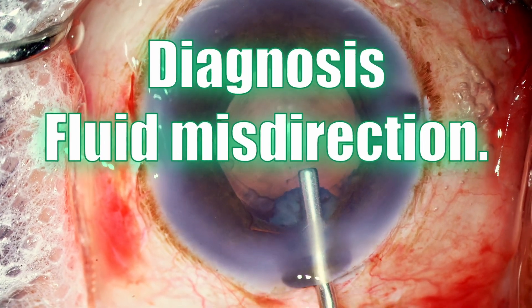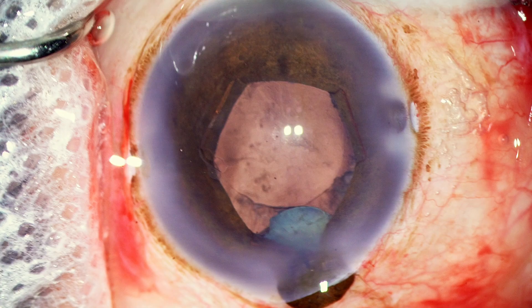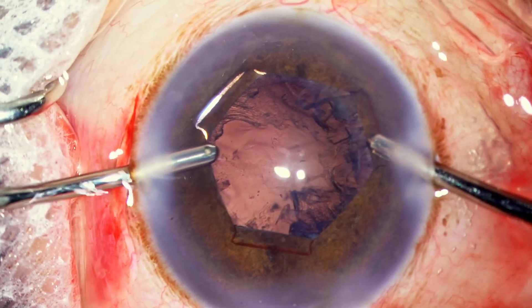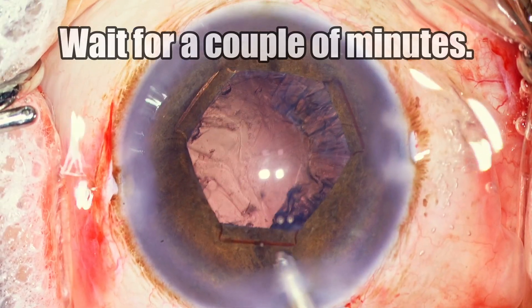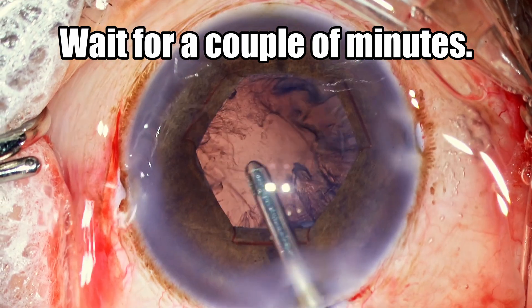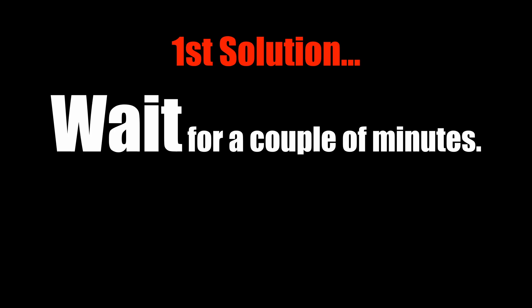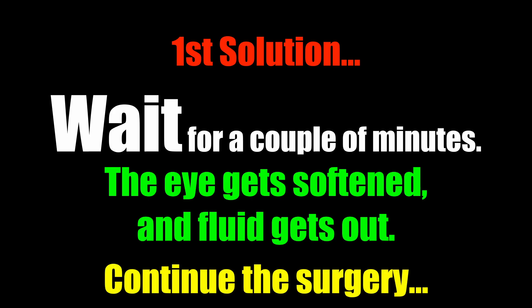So assuming your diagnosis is fluid misdirection, what do you do? There is still the last fragment to be emulsified and the pressure is great. We need to understand that whenever fluid gets access to the Berger's space, there is no valvular mechanism preventing it from coming out — it does come out; you just have to wait. The fluid which has gone behind the posterior capsule can come back across the zonules into the anterior chamber. The first solution is simply to wait for a couple of minutes: usually when you wait, the eye softens, the fluid gets out, and the anterior chamber can be reformed so you can go ahead and emulsify the last fragment.